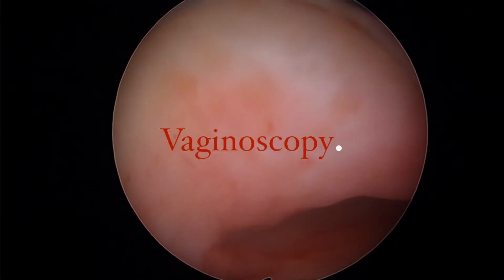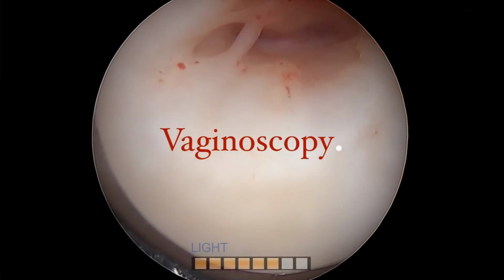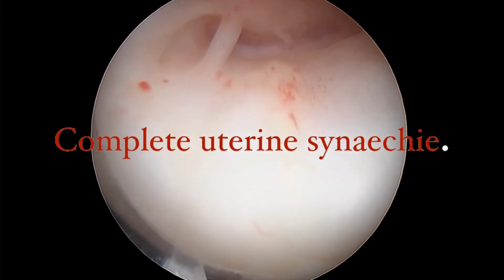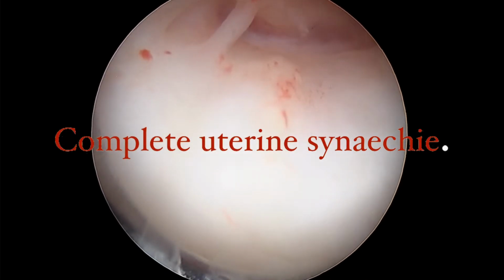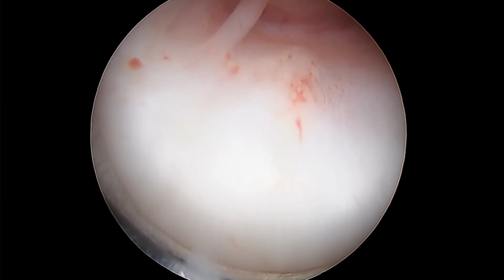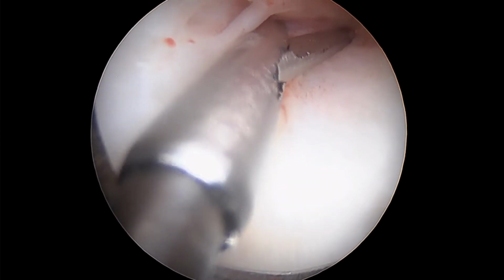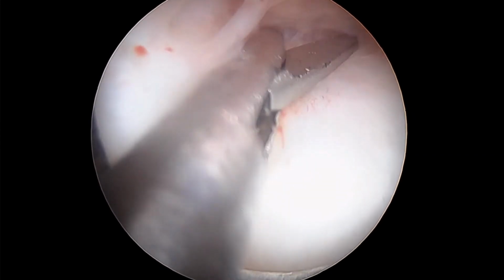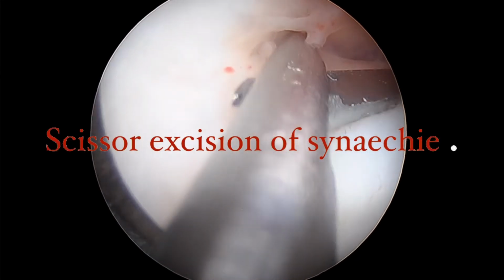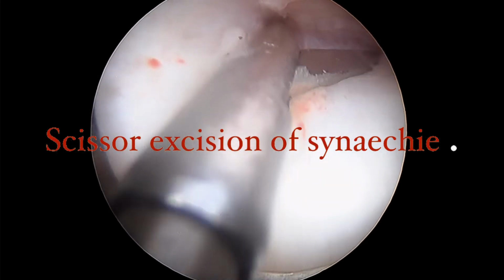Here you have a case we managed at our center of a lady who presented with total Asherman syndrome with closure of the uterine cavity, secondary to a previous evacuation of a missed abortion. And you can clearly see that when you put in a scope, there is total closure of the cavity right from the internal os. So we used scissor dissection.